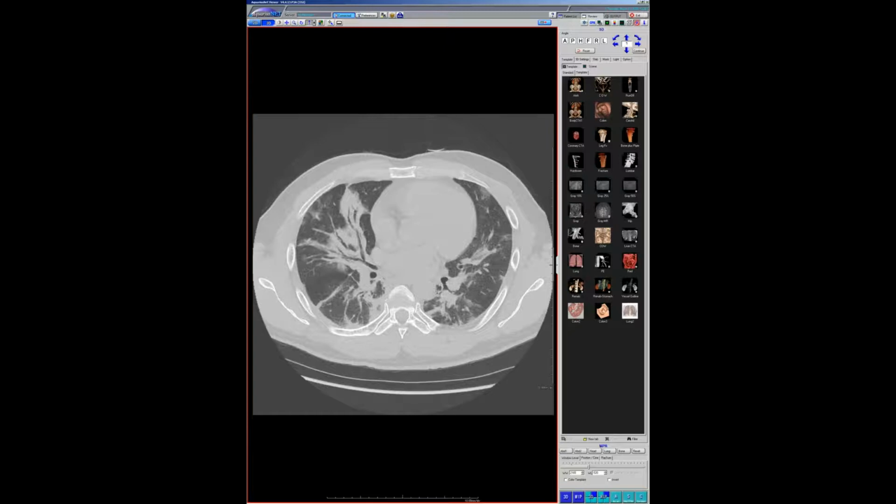And so a lot of the cases I've seen, I just have plain films. They're old people and they've got patchy pneumonia. It's in upper lungs and lower lungs. Sometimes it's just on one side. You think if this person came in the old days, you'd say this looks like a bacterial pneumonia, or sometimes it's in the base and you'd say it's a bacterial pneumonia, or it's aspiration. Sometimes it's widespread patches. It's not been diffuse and ground glassy, at least as you can determine ground glassiness on chest radiographs. But we all know it's that hazy stuff. Not supposed to call it, but we kind of do.